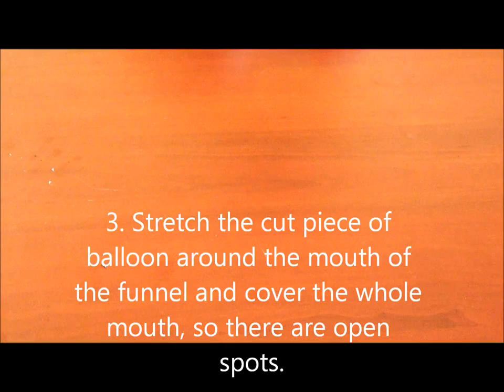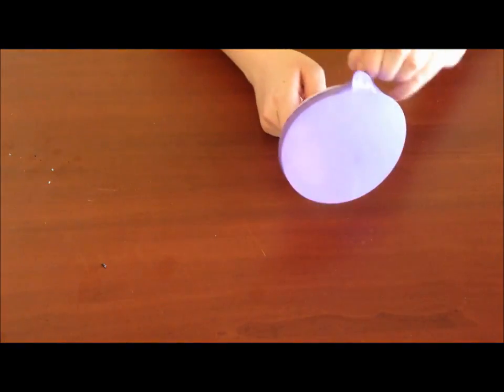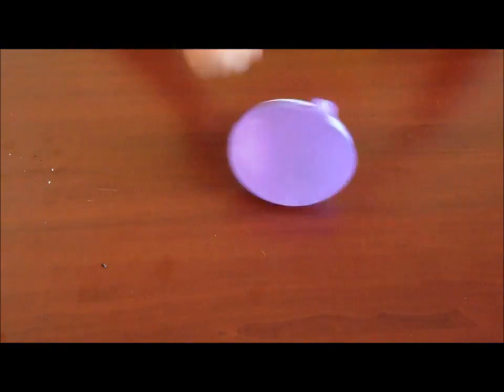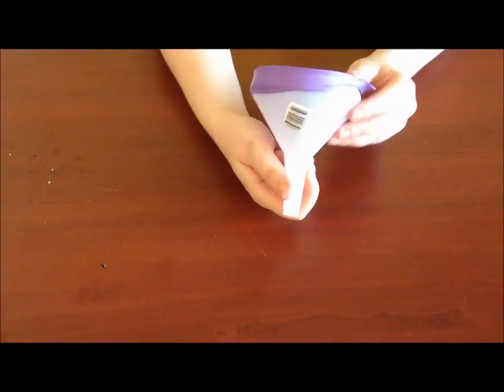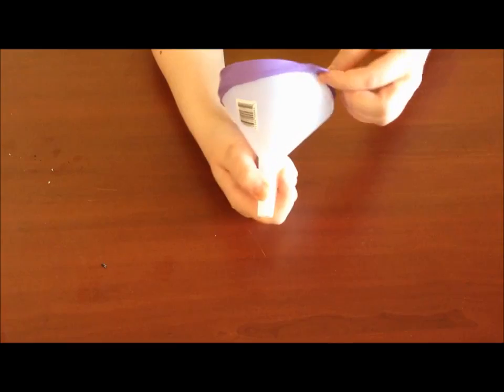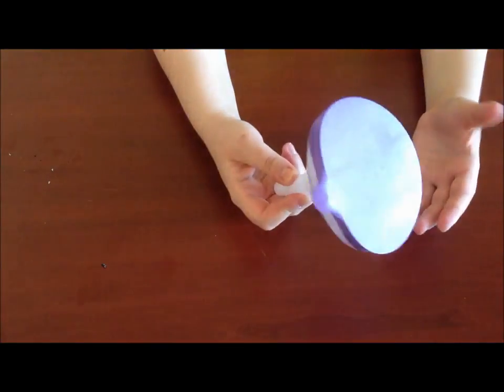Now, this part is kind of hard, so we're going to try to stretch the balloon all the way over the funnel. This is one of the most difficult parts. It's covering the entire funnel, otherwise our stethoscope will not work. Make sure all the edges are in and covered because any leakage could make it not work as well.